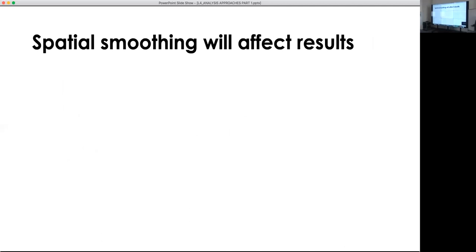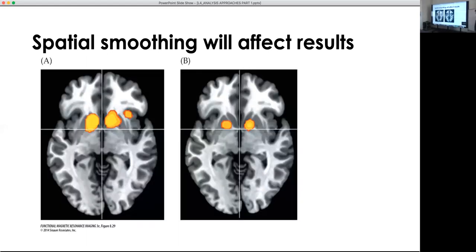As I mentioned, there are other issues. We're talking about subtraction, and then immediate issues come to mind, very standard ones in fMRI, like spatial smoothing. Again, I'm just taking this figure from that textbook, so what the experiment was doesn't matter. It's the same idea: some structural underlay, with p-values colored with a color map. On the left is the raw result, where you don't do any extra smoothing. And on the right, what you do is first smooth the data.